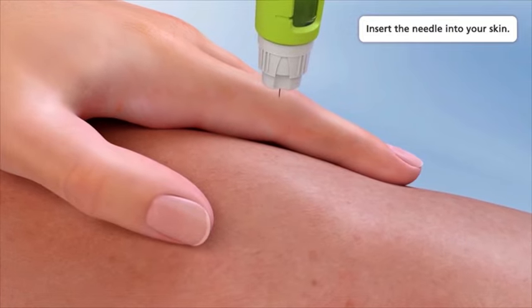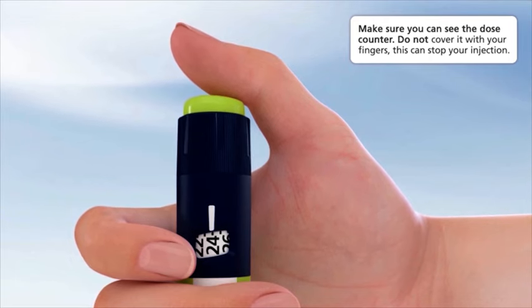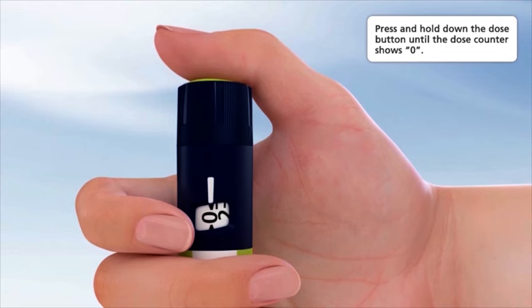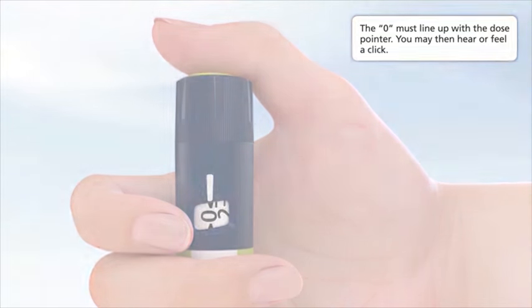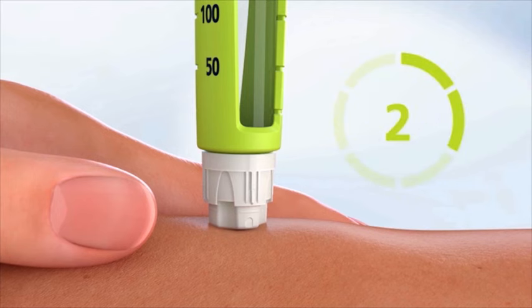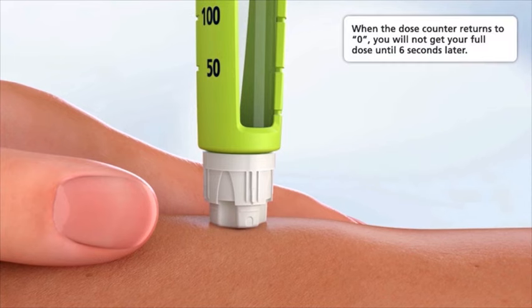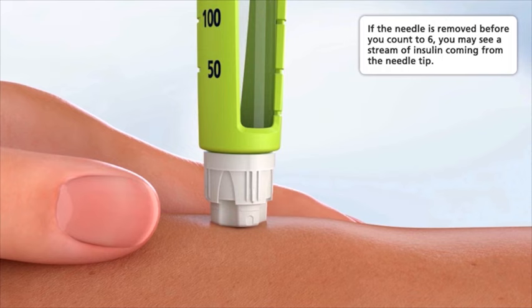Insert the needle into your skin. Make sure you can see the dose counter — do not cover it with your fingers, as this can stop your injection. Press and hold down the dose button until the dose counter shows zero; the zero must line up with the dose pointer. You may then hear or feel a click. Keep the needle in your skin after the dose counter has returned to zero and slowly count to six: one, two, three, four, five, six.